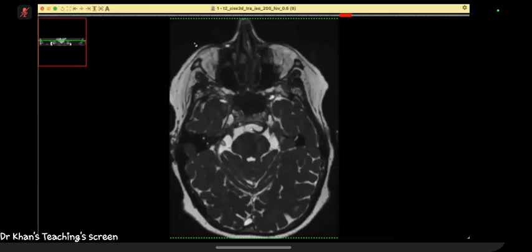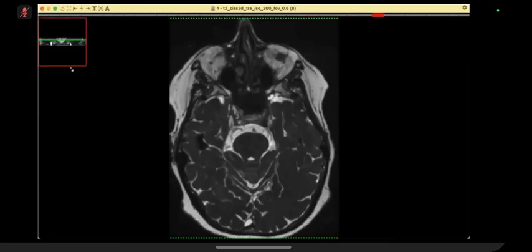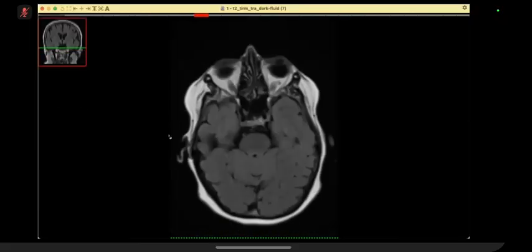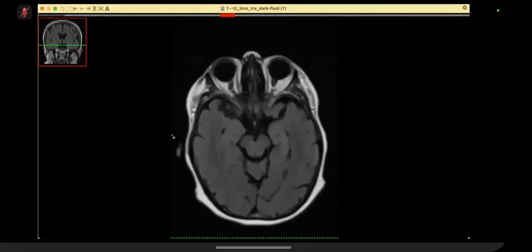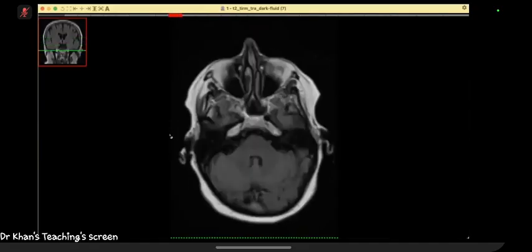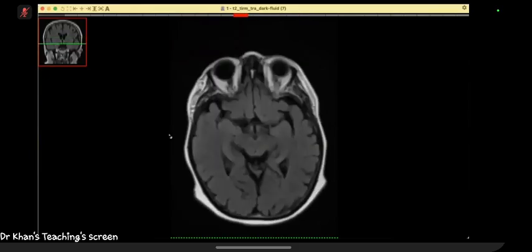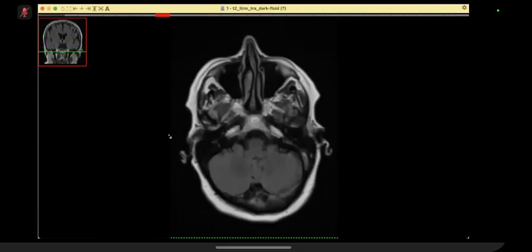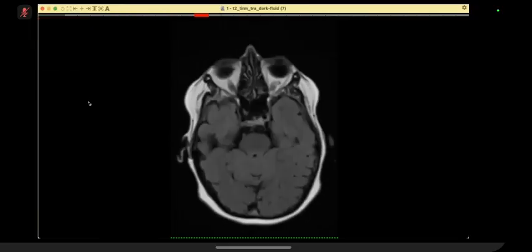So candidate, you did very, very well. I was very impressed. Well done. Basically, the only thing you got wrong was the name of the artery. Otherwise, you were spot on with everything. This was not visible on the FLAIR sequence, right? And another thing is your concept: you were asking for T1 with contrast, you were asking for MRA. You are never going to see it like this. You have to ask for a high resolution T2 weighted sequence.